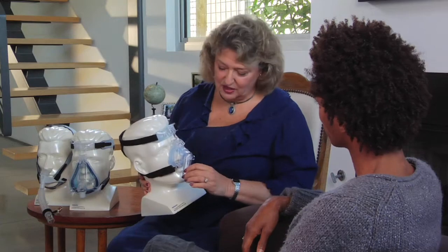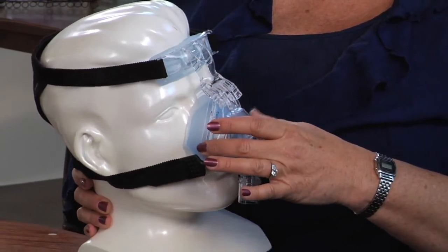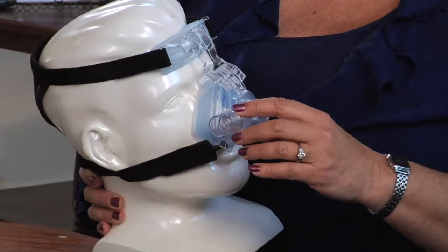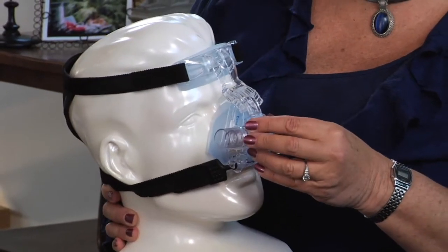And this is a nasal mask. It's a triangular mask that goes around your nose. This is for a person who breathes through their nose. As you can see, the mouth is open to room air.